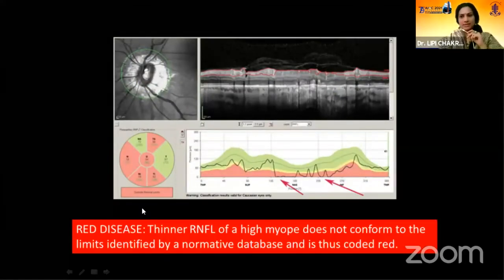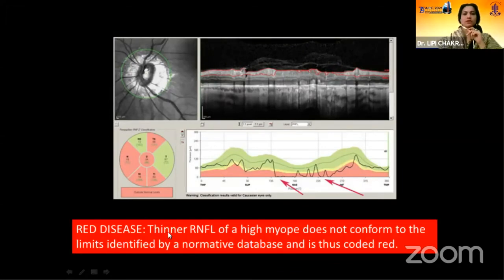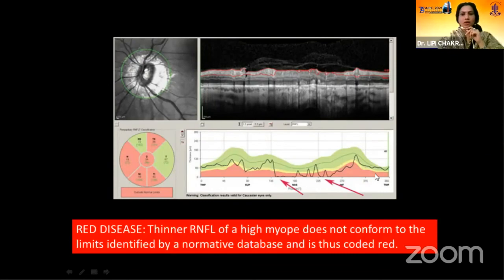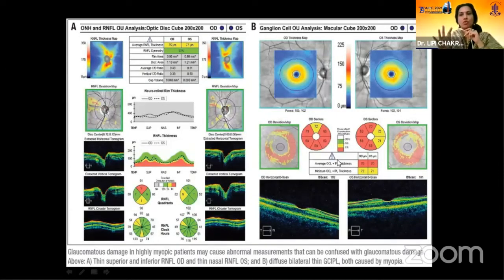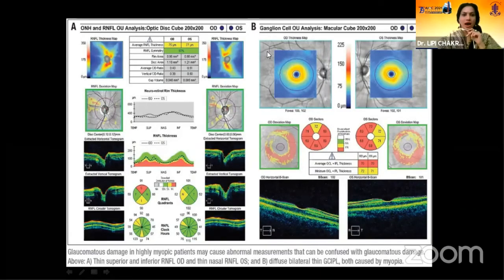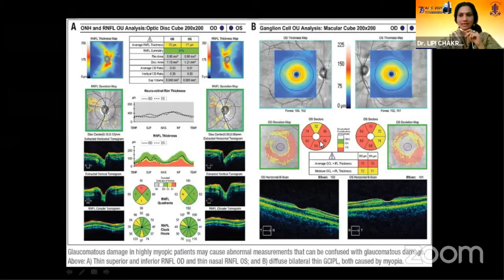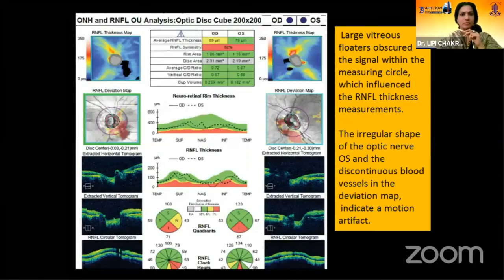Red disease and green disease — red disease is a false positive. The thinner RNFL of a high myope does not conform to the limits identified by the normative database, and so everything falls in red. For myopes, ganglion cell analysis OCT is more reliable data to rely on rather than RNFL thinning, which may be falsely read. Ganglion cell analysis OCT is the choice in myopes.